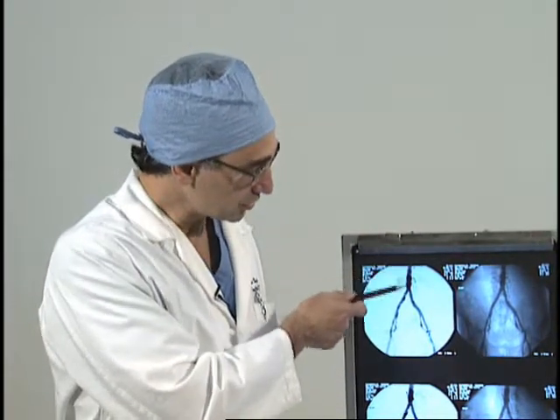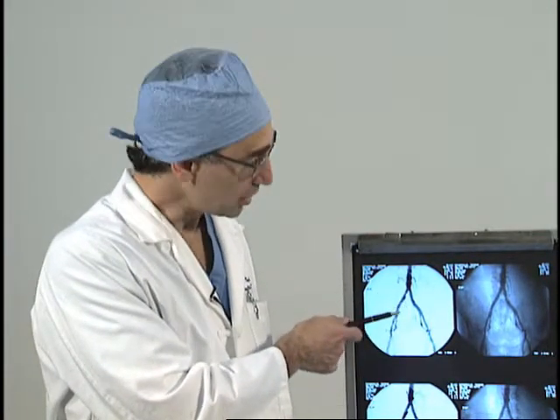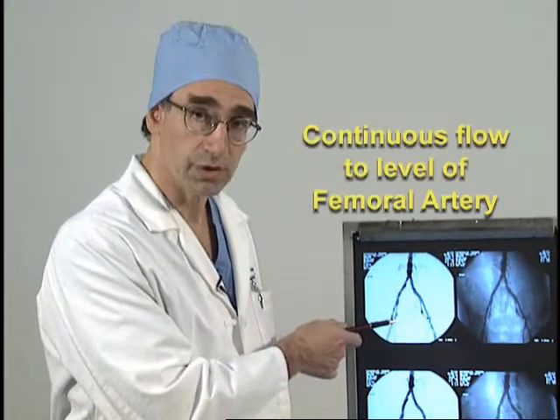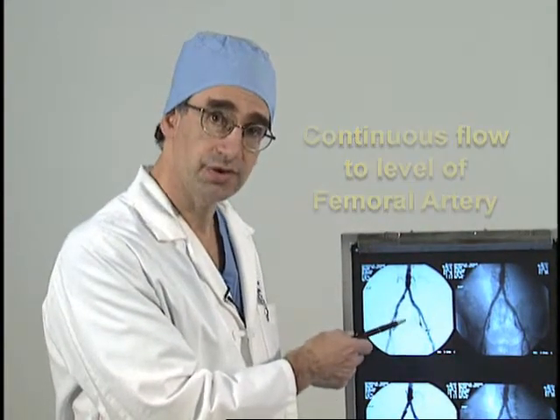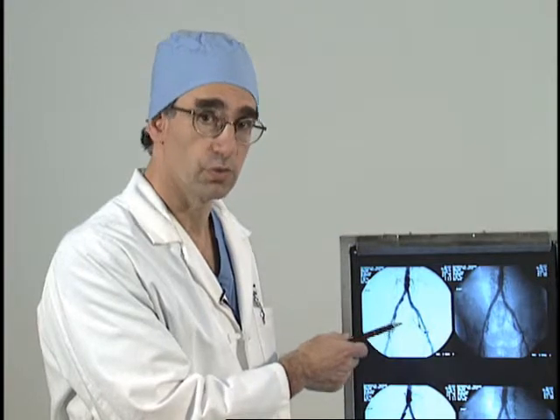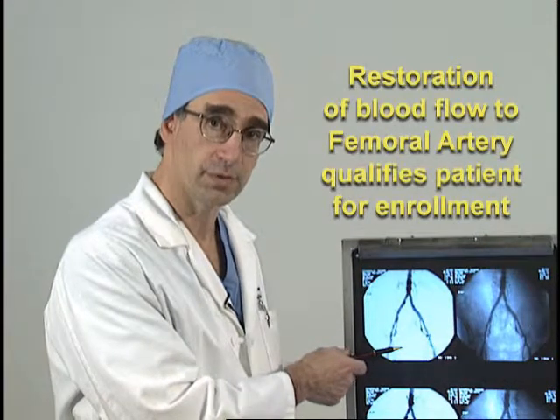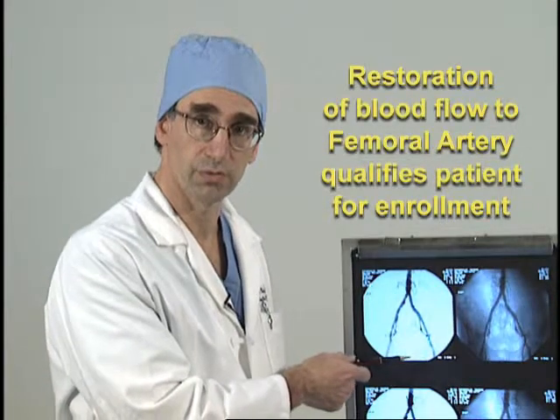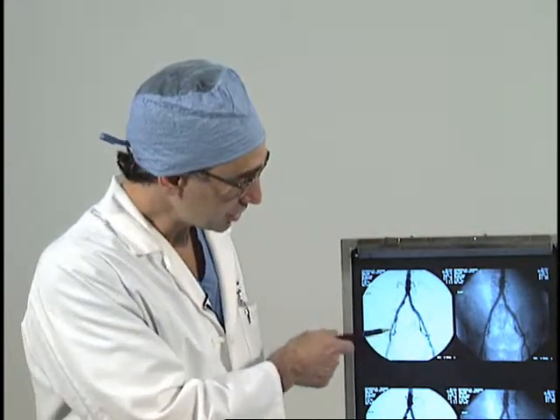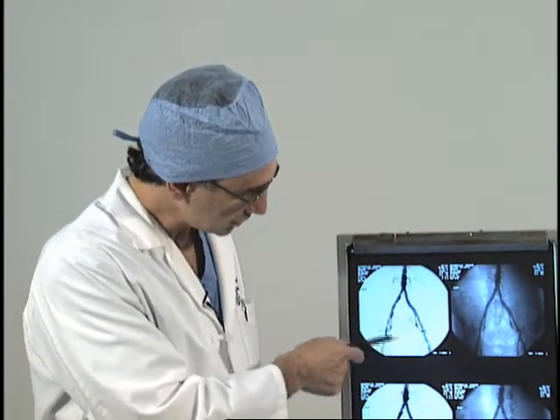This angiogram demonstrates an essentially normal aorta and iliac arteries. It's mandatory that there be continuous flow to the level of the femoral artery for enrollment in this trial. However, iliac lesions can be treated with angioplasty and/or stenting or bypass. Any revascularization option that restores blood flow to the level of the femoral arteries will result in the patient qualifying from that perspective for enrollment in the trial. In this study, we see a typical scenario of through and through flow on both sides, straight through the iliac and the femoral arteries.